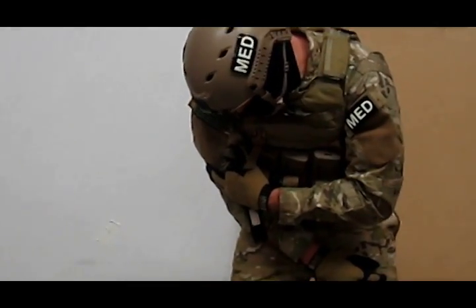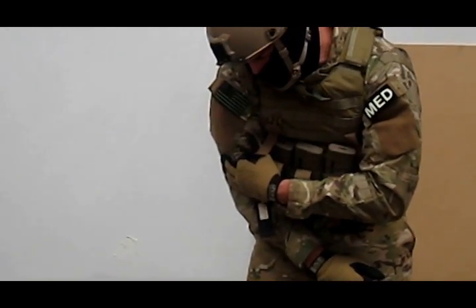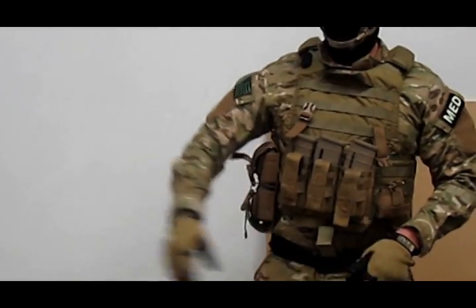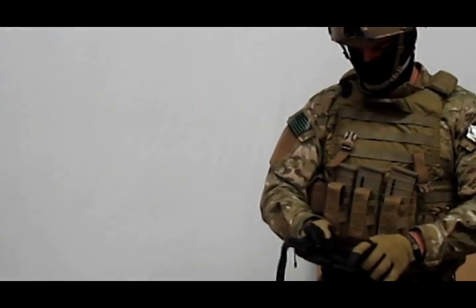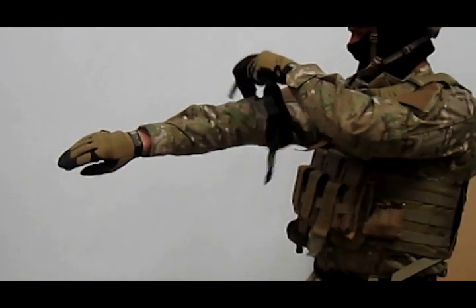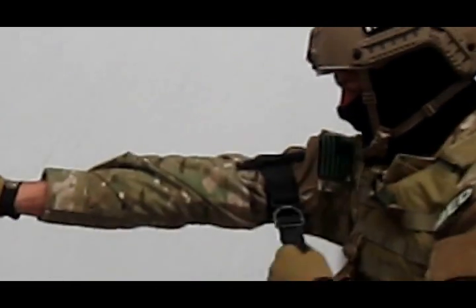Generally, a casualty with an upper extremity wound will self-splint and have minimal use of their limb, especially if there is bone involvement. So why do we train to self-apply tourniquets in this position? Applying a tourniquet to yourself in this manner is unrealistic and creates training scars.